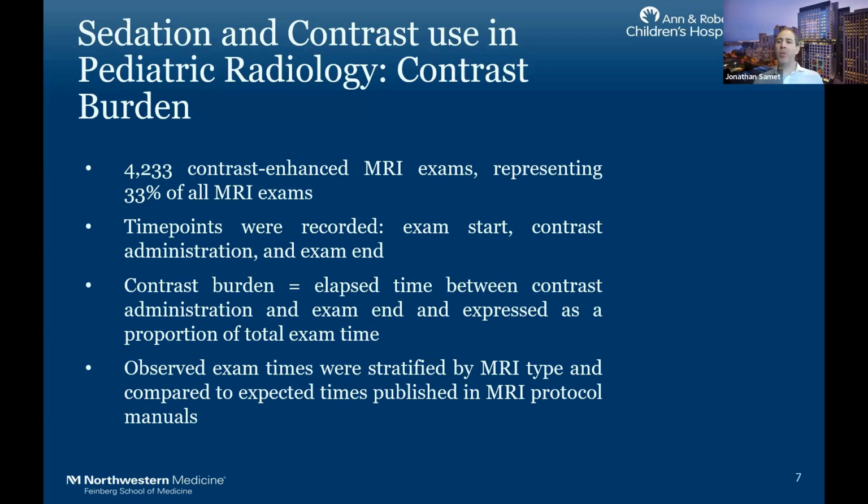Now you might say, wait a minute, we know the sequences, we know how long it says on the scanner, why do you need to do this whole study? But remember, there's a lot of dead time, right? There's a lot of time the technologist is checking the IV, the patient has to get up, all these things that we don't think about as radiologists.